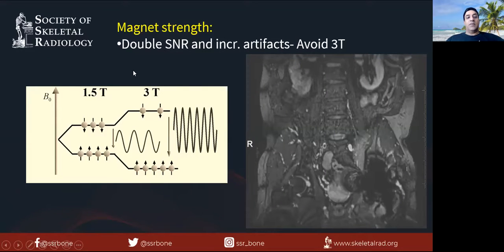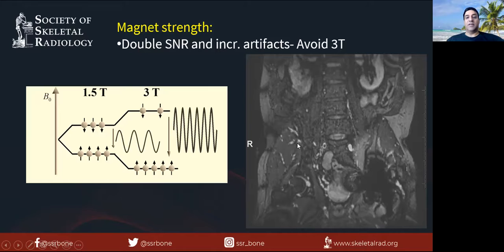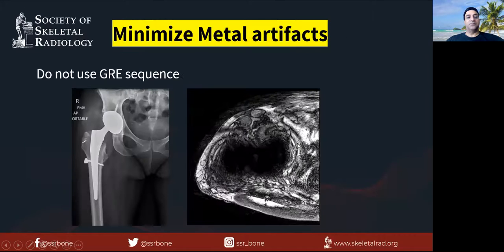These artifacts are more pronounced at higher field strength because there is more SNR, and there are more artifacts on 3 Tesla compared to 1.5 Tesla. That's why we limit our imaging to 1.5 Tesla. Here you can see there's a lot of artifact on a 3 Tesla 3D image.